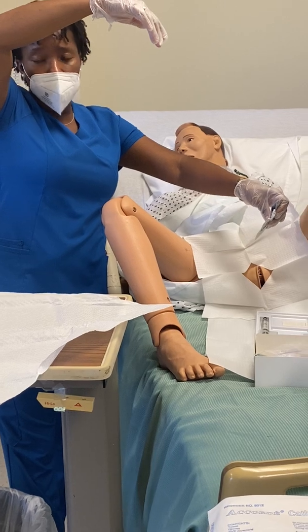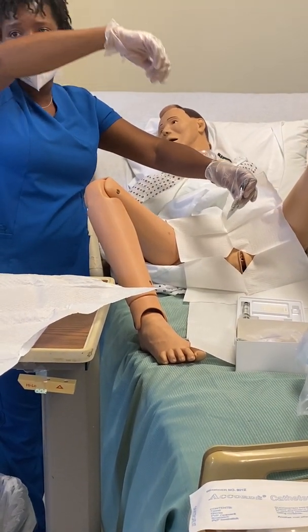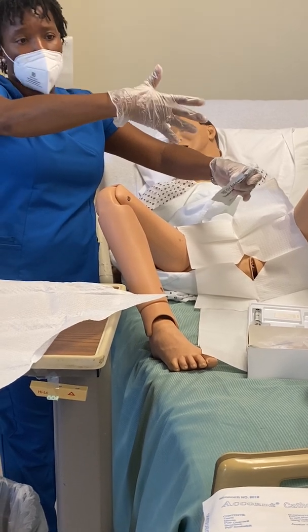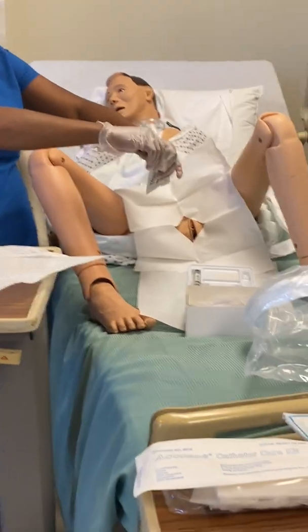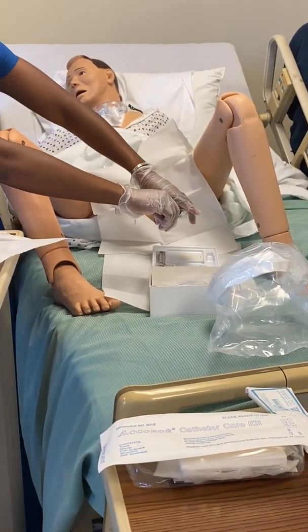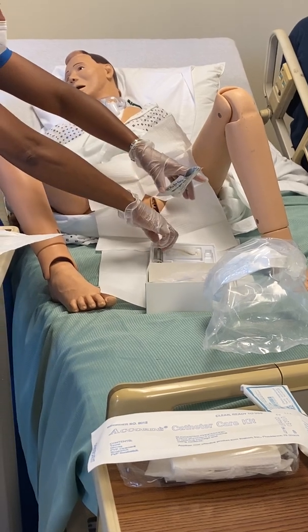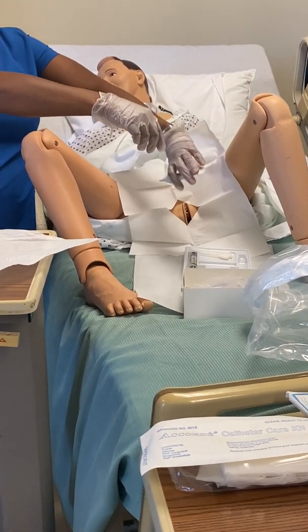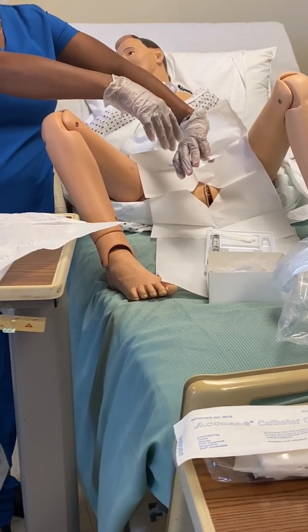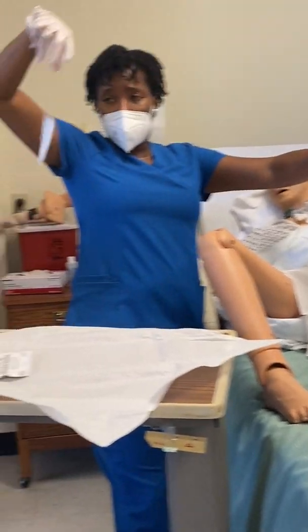Some people choose to use the bag where you have to go around, out, and back around to the bag. That's not my preference. If that's what you want to do, that's what you do. Okay? So then I'm going to put these here because this is what I'm going to use. Now, some students don't feel comfortable doing all of that because this is new. So if you want to leave them in the pack and put the pack upside down, everything is sterile here. Okay? So I'm going to come back around and drop.